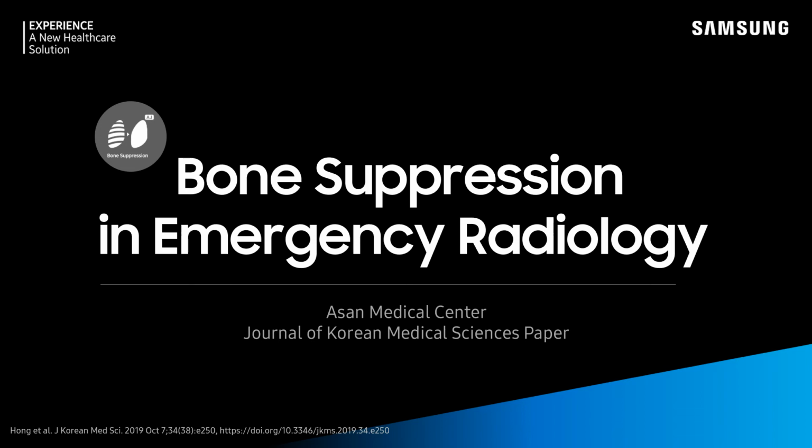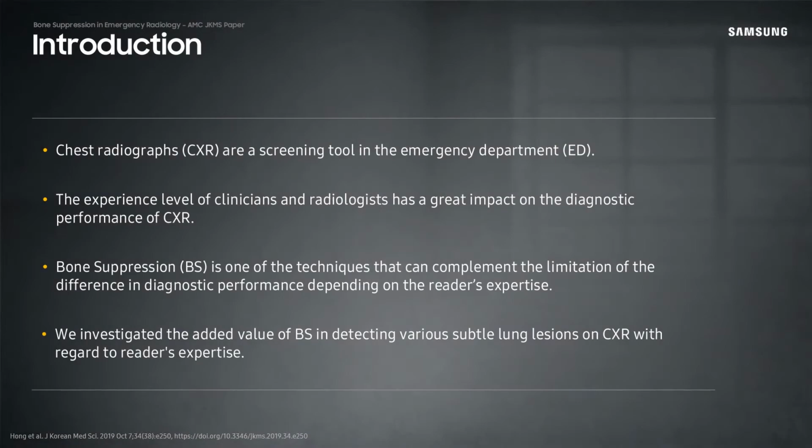Next, we will discuss the use of bone suppression in emergency radiology, a study that was performed in Asan Medical Center and published in the Journal of Korean Medical Sciences. As one of the most common radiographic exams, chest radiographs are often a screening tool in the emergency department. The experience level of clinicians and radiologists has a great impact on the performance of chest X-rays.